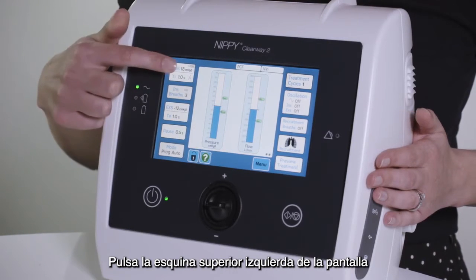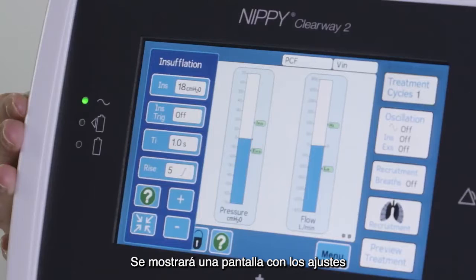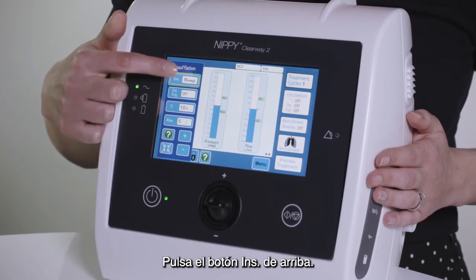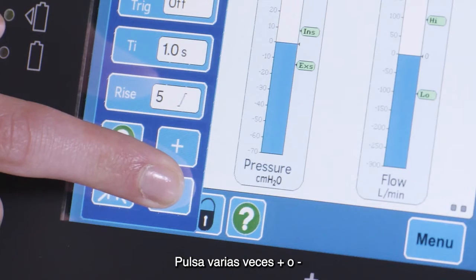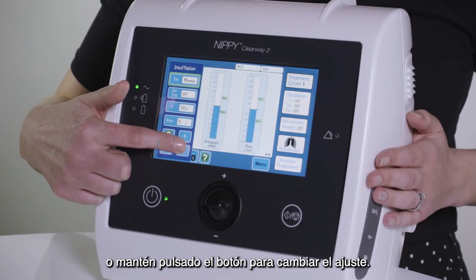Press in the top left corner of the screen where the insufflation pressure setting is displayed. A window will appear displaying the settings that can be applied to insufflations. Press the top button labelled INS. Use the plus and minus buttons at the bottom of the window to change the setting. You can repeatedly press the plus or minus button, or press and hold the button, to change the setting further.